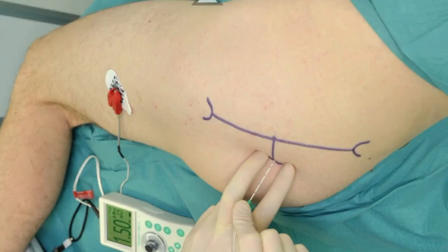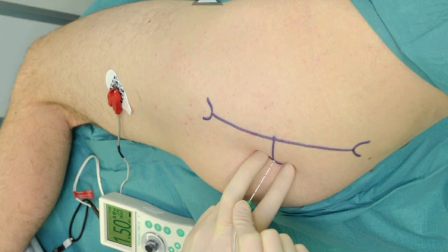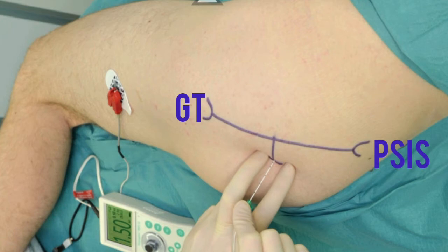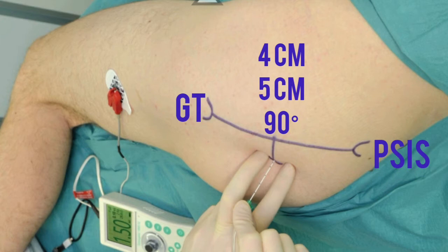Classic posterior approach to sciatic nerve block. Draw a line connecting the greater trochanter and the posterior superior iliac spine. Now draw a 4 centimeter perpendicular line from the midpoint of this line.